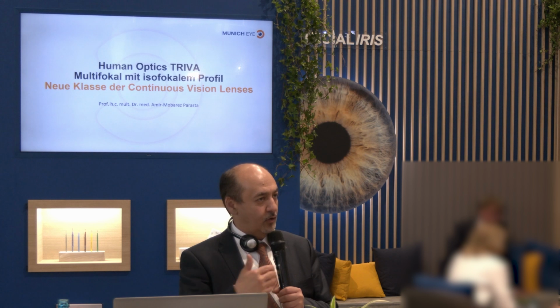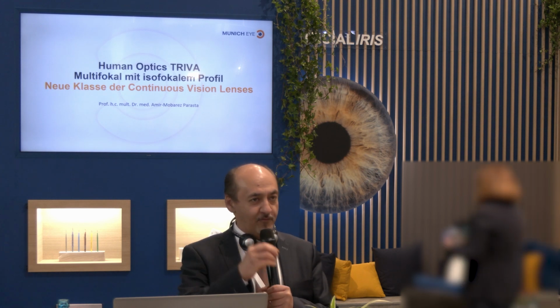Currently, we essentially have monofocal, monofocal plus, and the so-called CV lenses, continuous vision. These are lenses with more than 2 or 3 foci, essentially polyfocal lenses, and this is what we refer to with modern lenses. Let's make a brief comparison with how it was before.